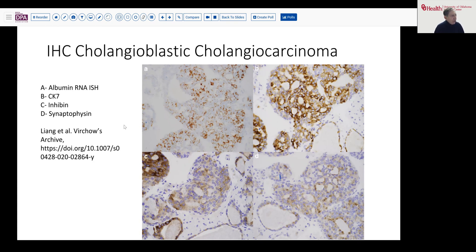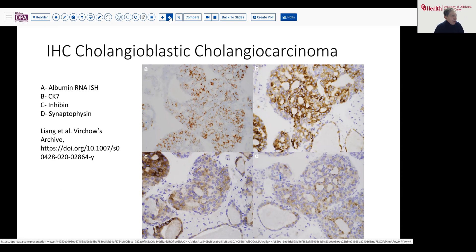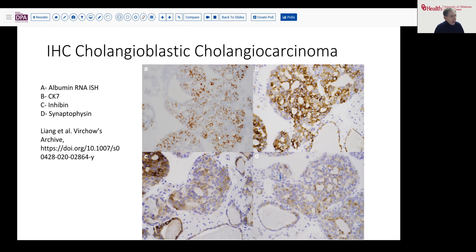And synaptophysin can also show some intermediate level positivity. So all those features are quite characteristic of cholangioblastic cholangiocarcinoma. I would encourage you, when you see this sort of solid multi-cystic or thin follicular pattern, to consider that in your differential diagnosis on a liver biopsy.